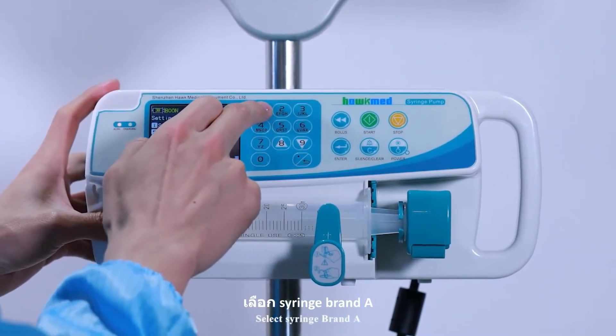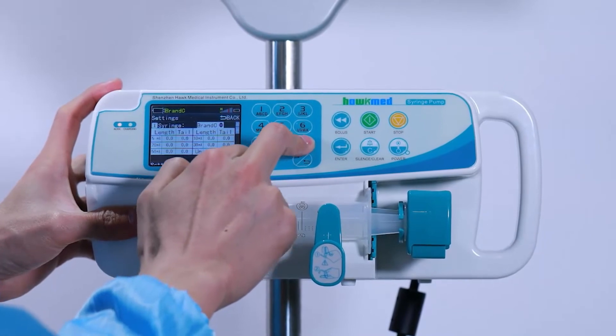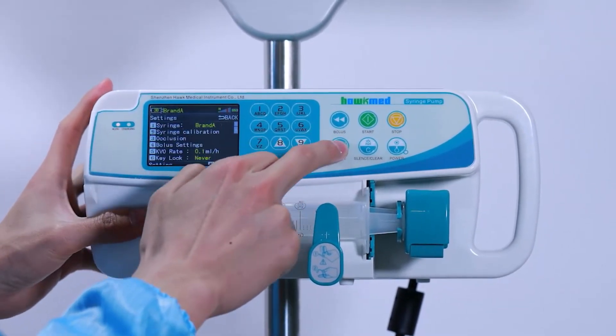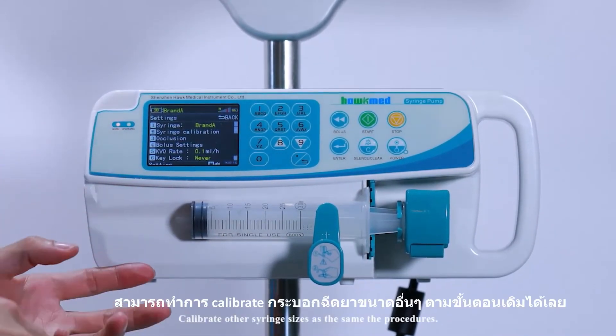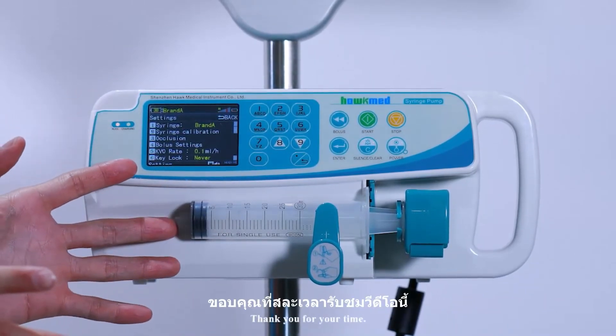Select syringe brand A and press enter. Calibration is now finished. Calibrate other syringe sizes following the same procedures. Thank you for your time.